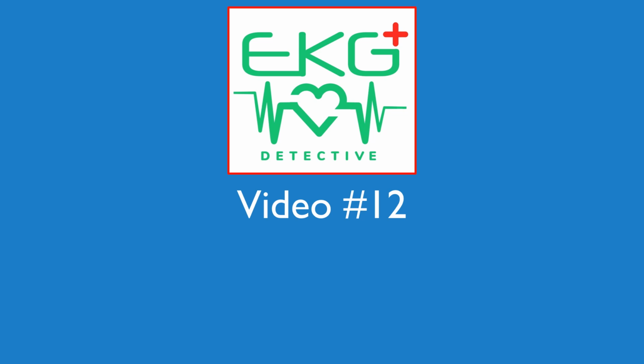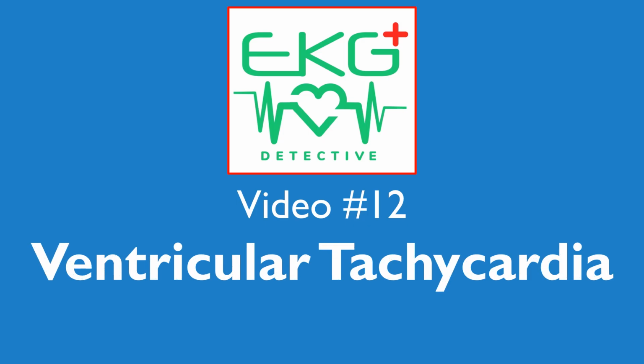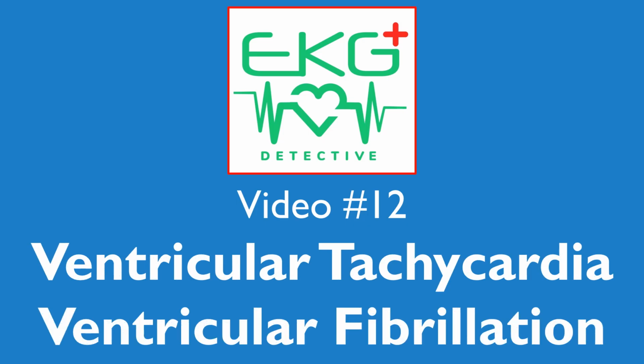Welcome back to video 12 of the EKG Detective. For this video, we will be looking at ventricular tachycardia as well as ventricular fibrillation.